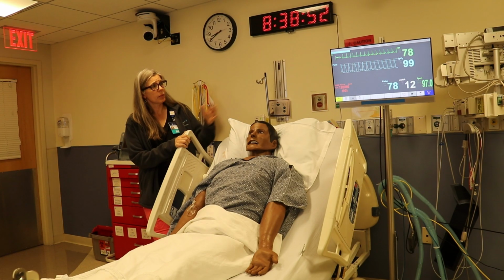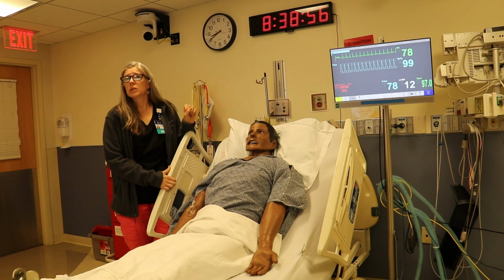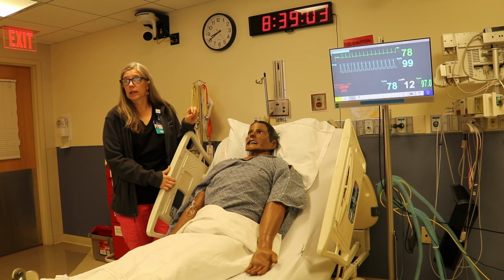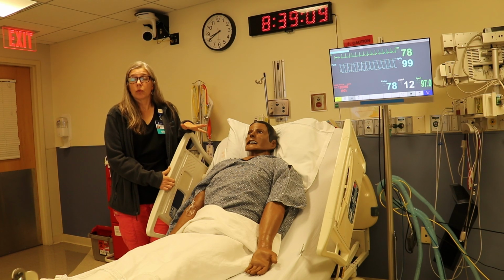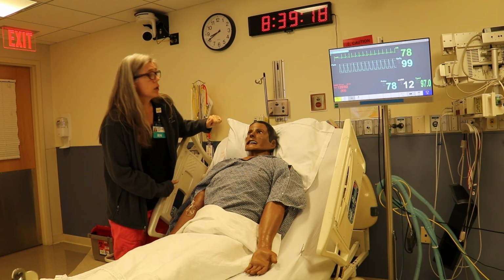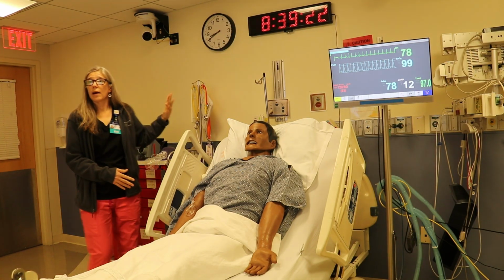We have a patient bedside monitor here. The monitor will display patient vital signs and potentially additional information that you need to move through your simulation scenario. The screen is interactive and touch activated. Initially, the vital signs that are displayed will be determined by the learning objectives in your simulation scenario. You can touch the screen at any point to get additional information, especially you can hit start and stop to repeat your blood pressure. And finally, we have our code cart.